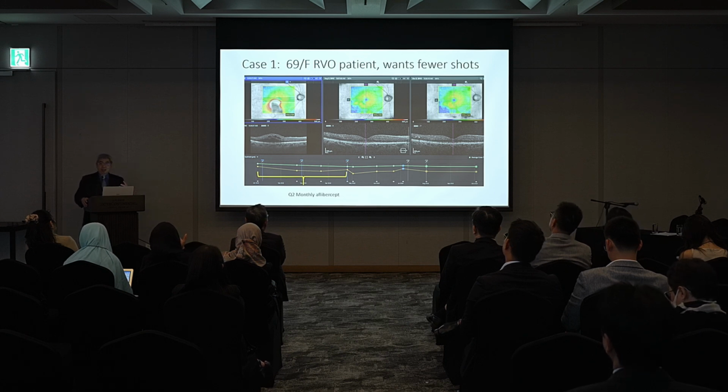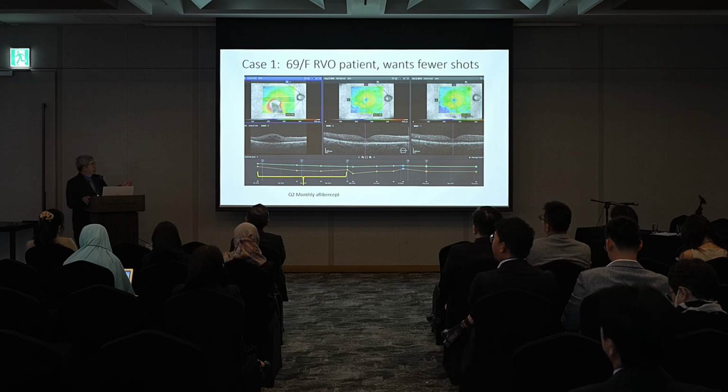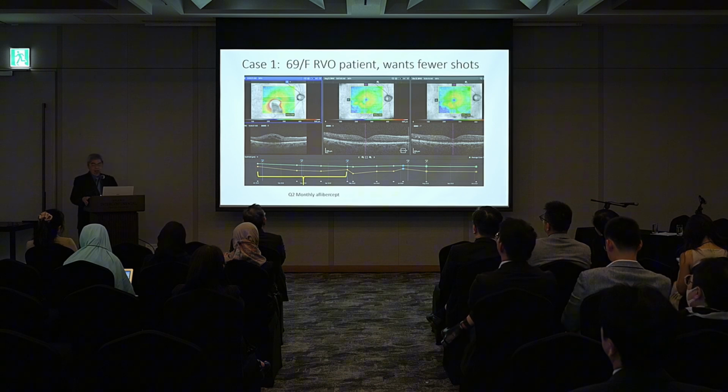And in our practice, we generally color code it. There's a standardized color code as to what medicine corresponds to what color. So here you can see in the first dot, there's edema. This is the left-handmost screen with the heat map showing a lot of edema. And we convince the patients to get an injection. We get an injection and they come back sometime later. And you can see that the yellow line has gone down, indicating that there is a good response to the treatment.